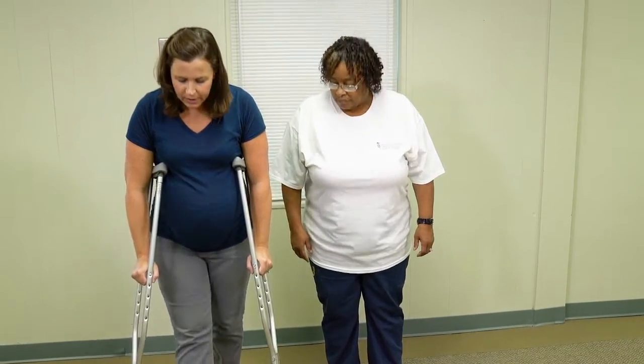I highly recommend starting with a small hop with your unaffected leg, and then as you become more comfortable with the crutches, you can start to increase the size of that. But you always want to start small to stay safe.